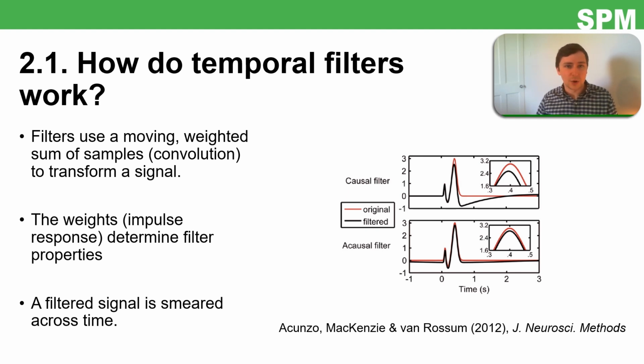That's a take on electrical filters, which happen in real time, and they can, of course, only consider previous samples, I suppose. The other thing you can do is apply a filter forwards if you've already recorded it, and then backwards, or essentially have weights either side of the output.